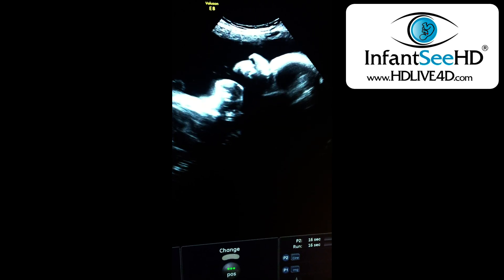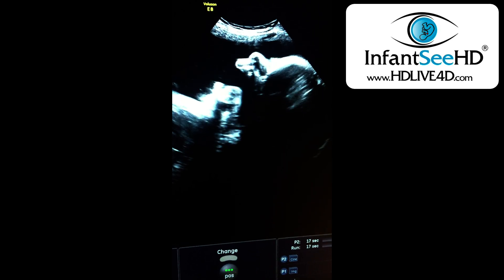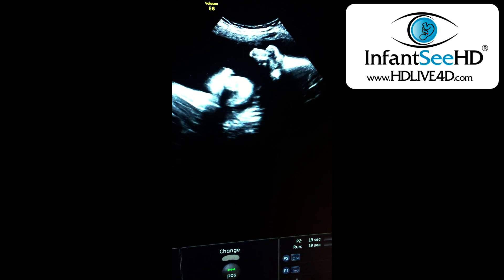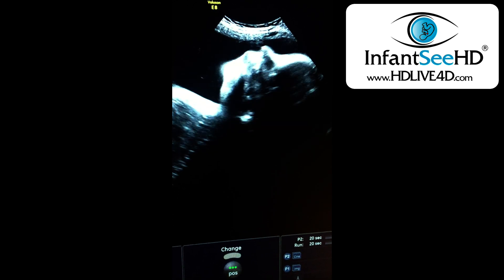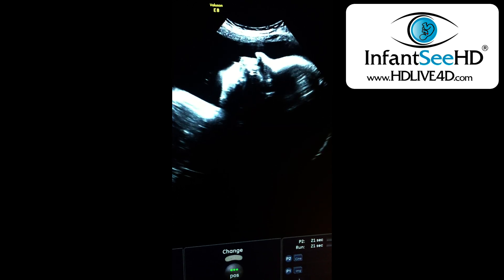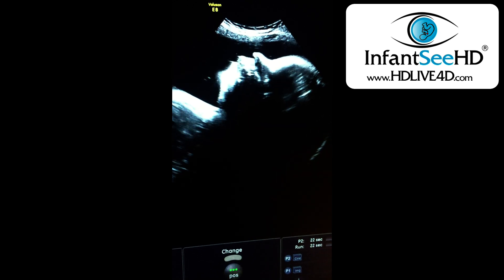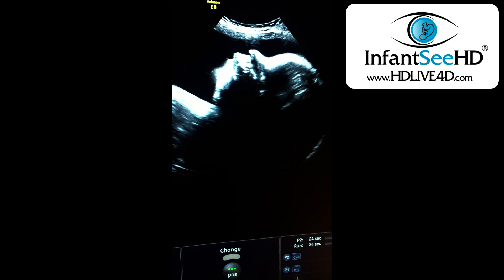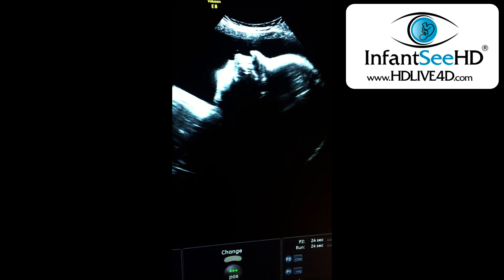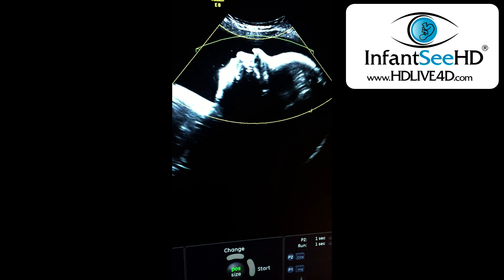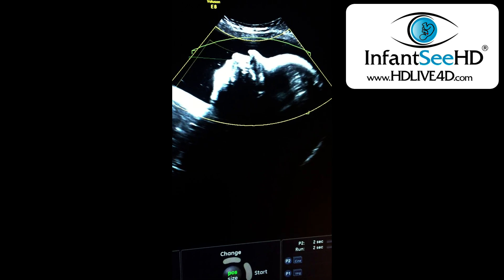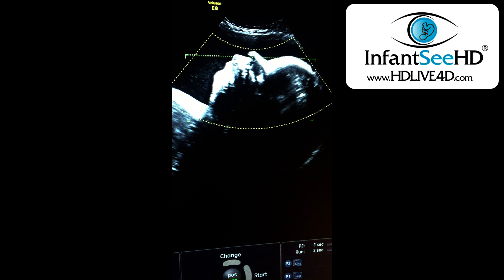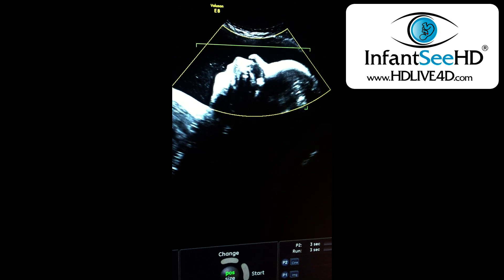I'm going to show you the difference between 2D, HD, and HD live — look at the baby yawning. All this black is fluid, so mommy did an incredible job drinking. There's plenty of amniotic fluid over here in front of the baby.